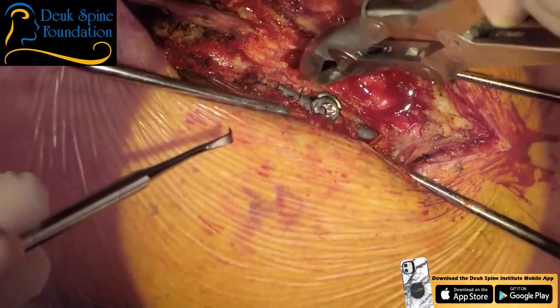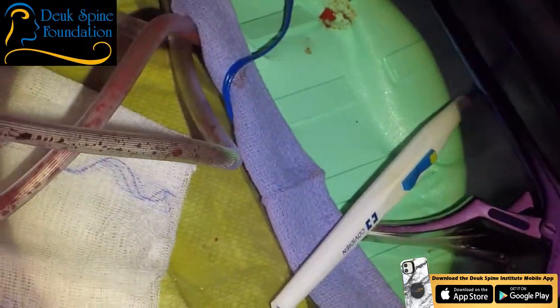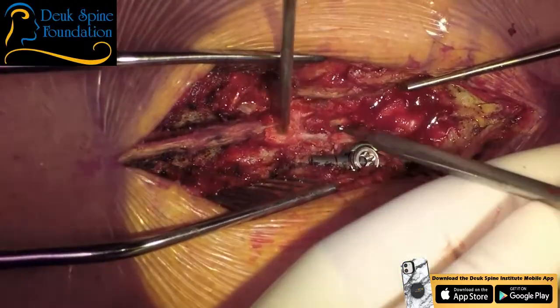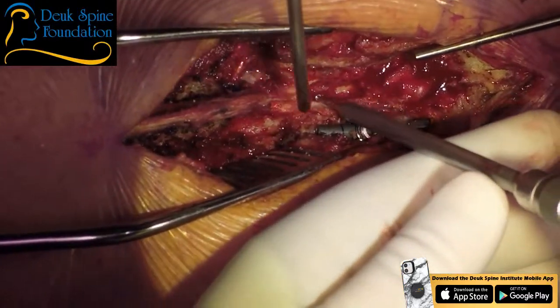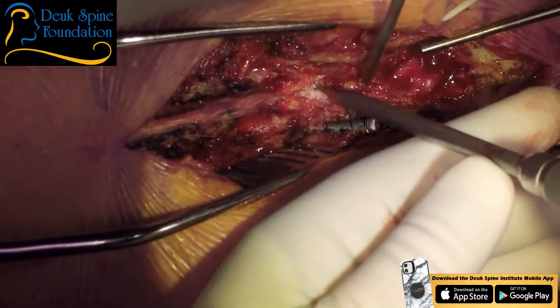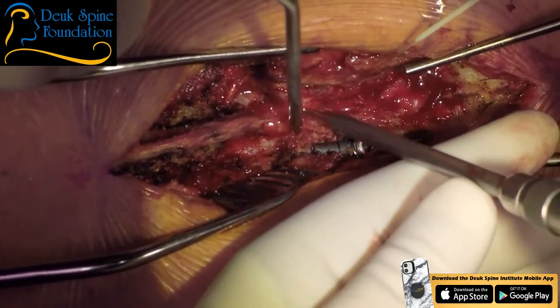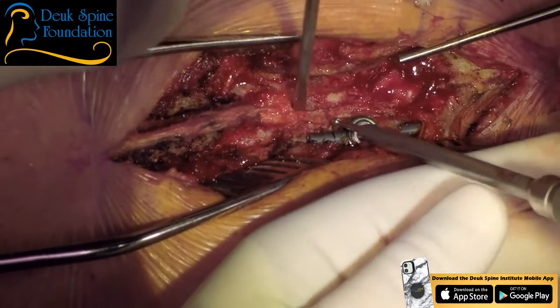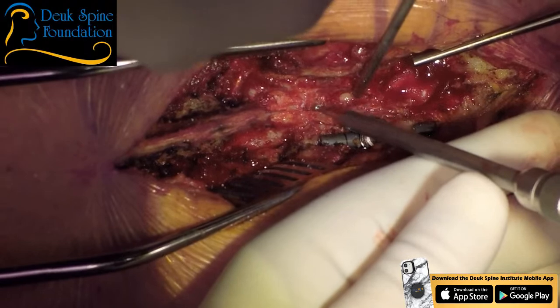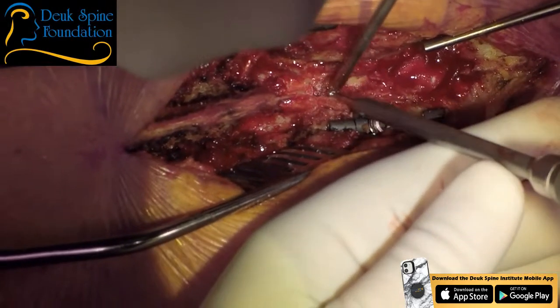So I am trying to figure out the best, safest way, to take that drill, to clean out this space, called a laminectomy, where the lamina is. Suck here. And what I mean by best is safest for the patient. Because the spinal cord is just under here. We don't want to injure it.